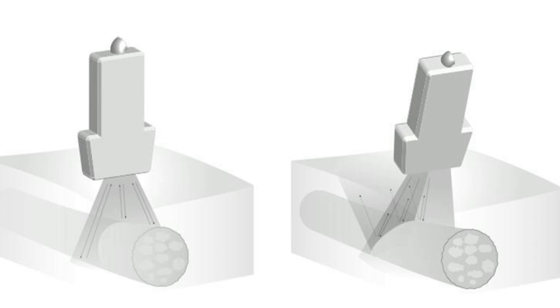Another image to further explain this concept: on the left side the ultrasound probe beam is perpendicular to the nerve structure, giving a better view. On the right side the angle of insonation is not 90 degrees, so we expect the image of the nerve on the right to be not visible or barely visible compared to the left.